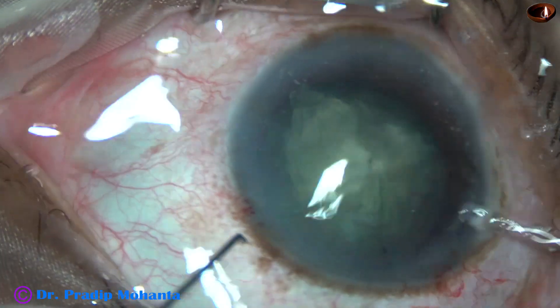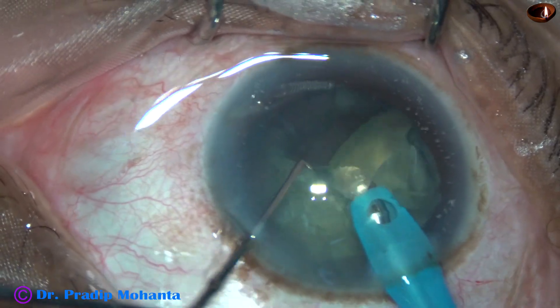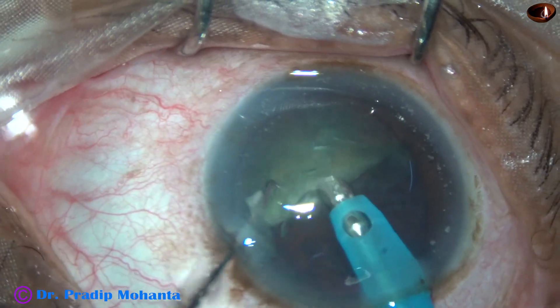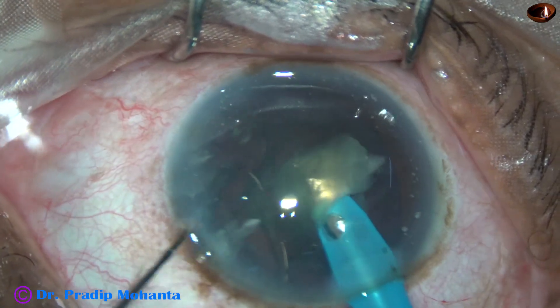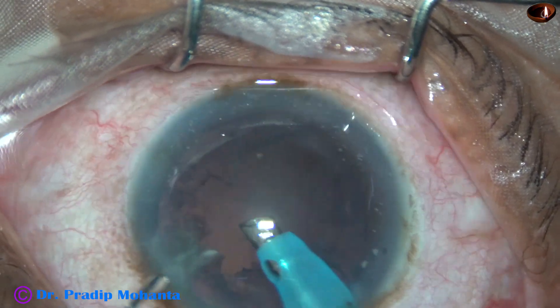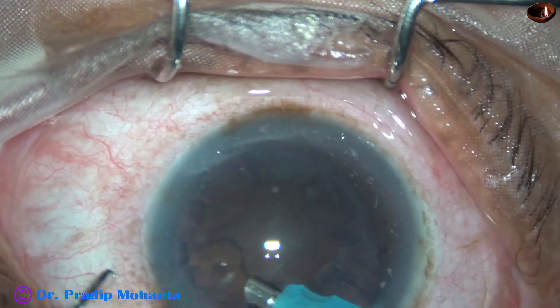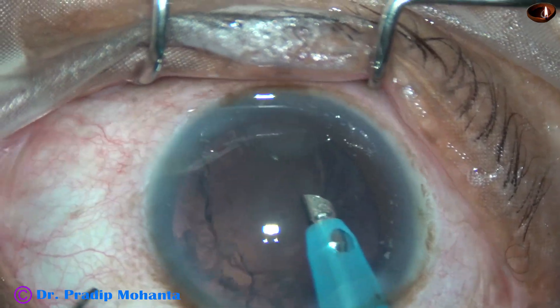The phaco needle goes in bevel down. One piece is picked off and emulsified, and then the other piece is picked off and emulsified. Now this hemi-nucleus is pierced at the center and divided into two pieces. Each piece is then emulsified with ultrasonic energy, which is set at 65% in all these cases. However, less energy was required to emulsify these nuclei. All of these cases have been soft nuclei.